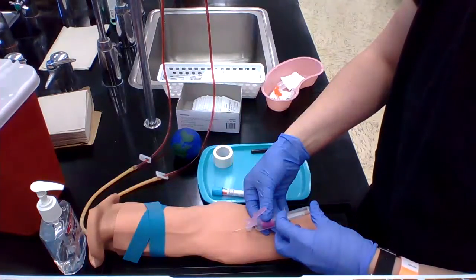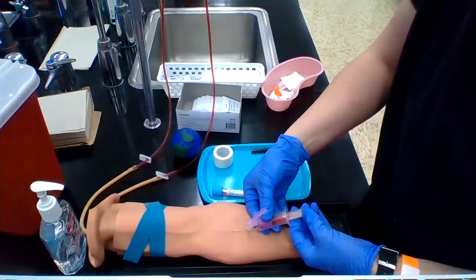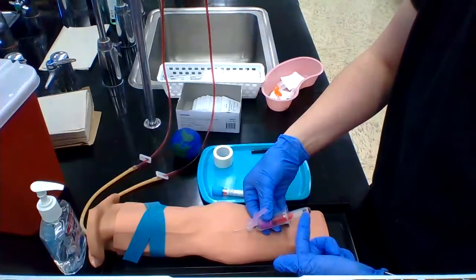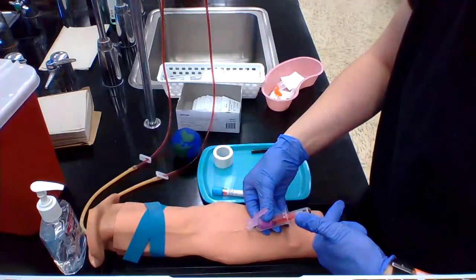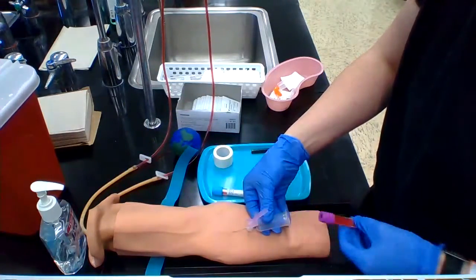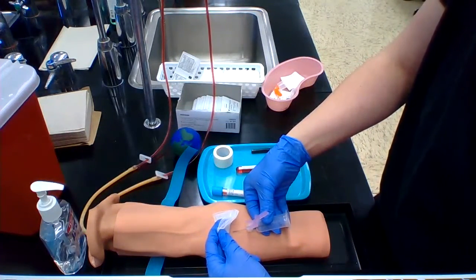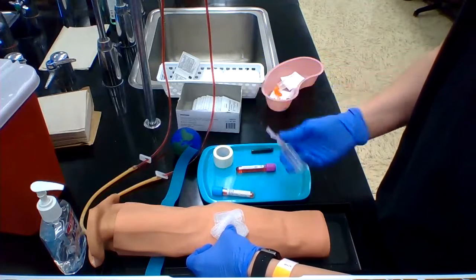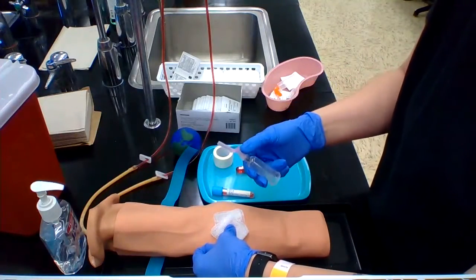You'll know when you have enough blood when the blood stops flowing into the tube. It's called a vacutainer tube because there is a vacuum inside — when that vacuum is broken by the needle inside your holder, it pulls in blood and will only pull in as much as is needed for that tube type. When your last tube is halfway done, undo your tourniquet and pull out the tube. Grab some gauze, shield the patient, do not press down on the needle — pull out in a smooth motion, then press down and activate your safety device pointing away from yourself and the patient.